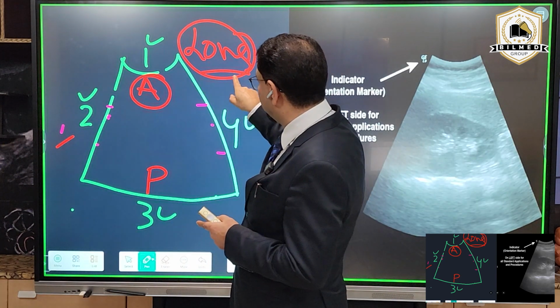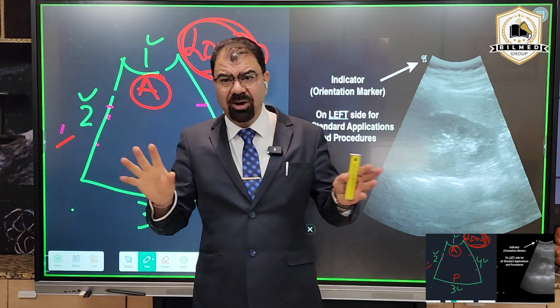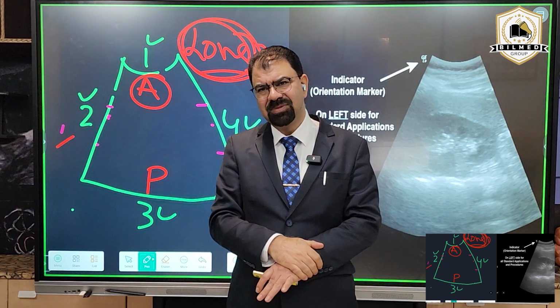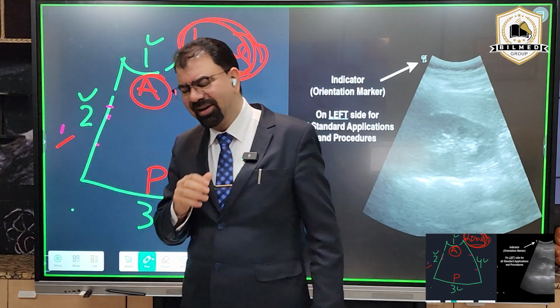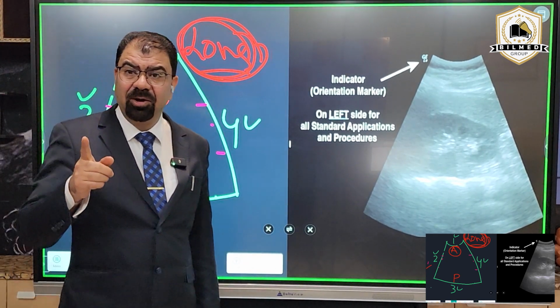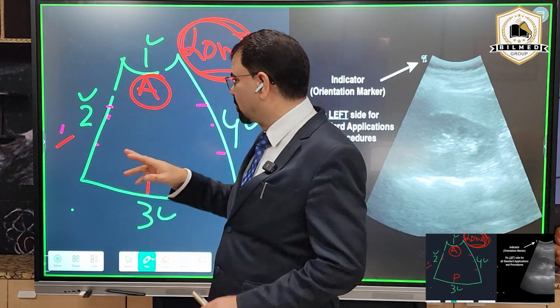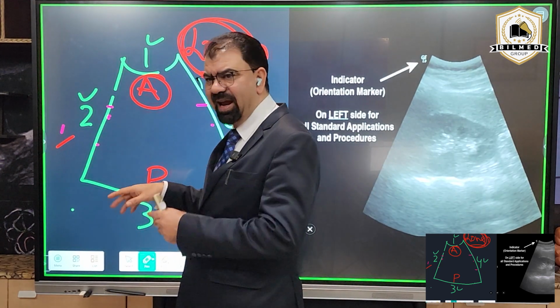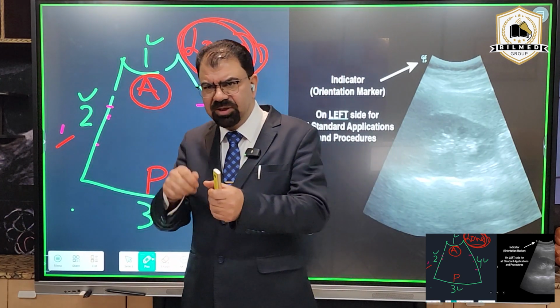I told you thrice that I am in longitudinal section. There is no right and left in longitudinal section. This is the importance of the screen orientation. So there is no point of having right this side or that side. Please make a note of this. These points are very important.